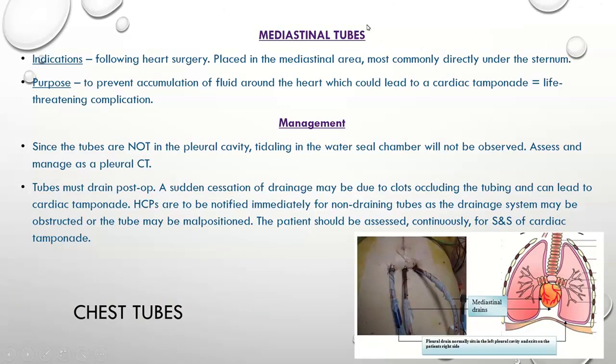Mediastinal tube. So this is kind of a separate topic. You can see here, it's not a really great picture, Google it if you don't like it, but here's the mediastinal space, and when individuals have cardiac surgery, usually it's a valve job on a cardiac valve or bypass surgery, so they do a lot of slicing and dicing on the exterior portion of the heart, and whenever that happens, inflammation, because that's part of healing, can occur, and that will cause a lot of serous fluid to leak into this mediastinal space.